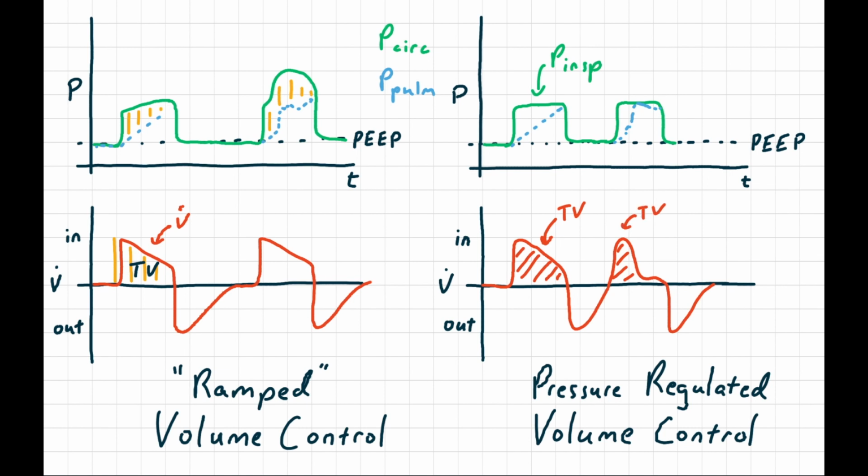On the next breath, the ventilator computer is going to increase the inspiratory pressure to try to increase the tidal volume. It can't tell the difference between a transient cough and a more permanent decrease in compliance, and that can result in too high an inspiratory pressure and too big a tidal volume on the next breath. Of course, in one more breath this would be corrected, and there are in these modes always upper limits on how much inspiratory pressure the ventilator will apply.